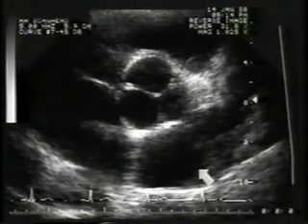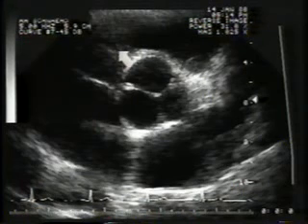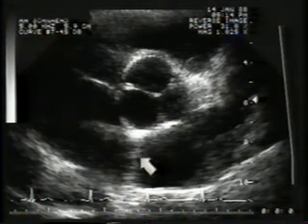Next, the transducer will be tilted to the base of the heart, to the level of the aortic valve. In this still frame, the left atrium is visualized behind the aortic valve. This is the left atrial appendage. The right ventricle, right atrium, tricuspid valve, and atrial septum are only partially visualized.